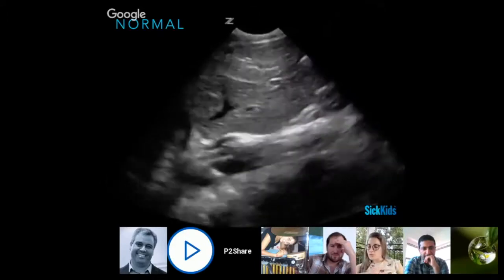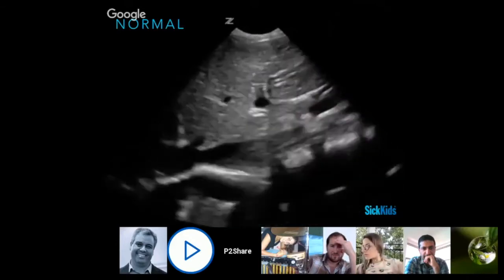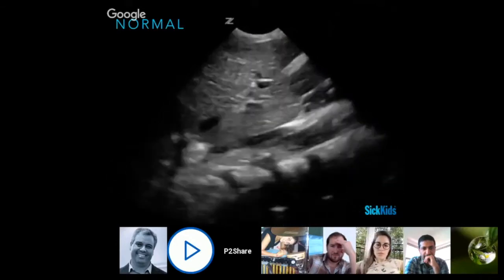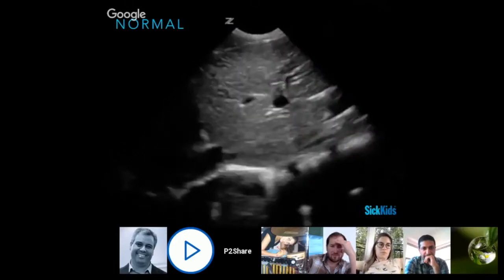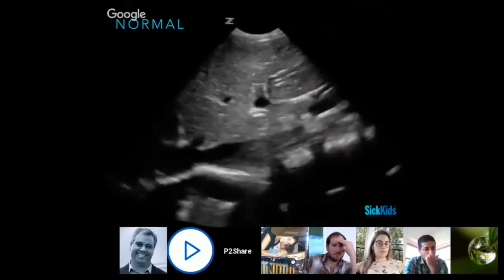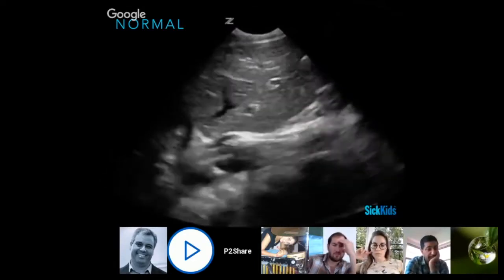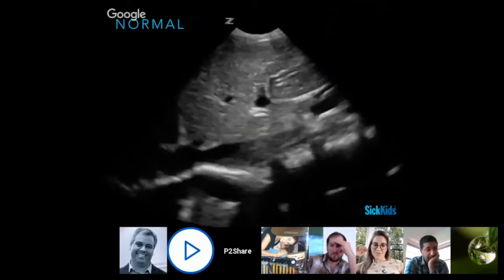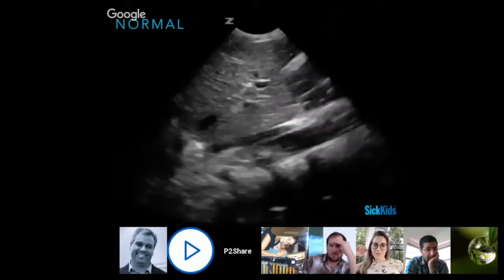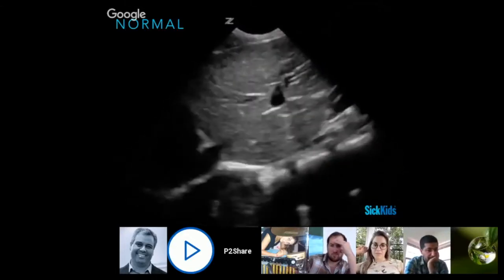And so when you see that happy whale, the big thing I always tell folks when you're doing it is try and look to see, just to be clear to yourself that that's exactly what you're seeing, that it is leading into that right atrium. So tilting your probe up and seeing that you're entering the heart there is basically anatomically telling you that you're definitely looking at the IVC. Because some people, I don't think it happens that often, but can be misled by the aorta, which you're not going to be seeing that kind of property with.